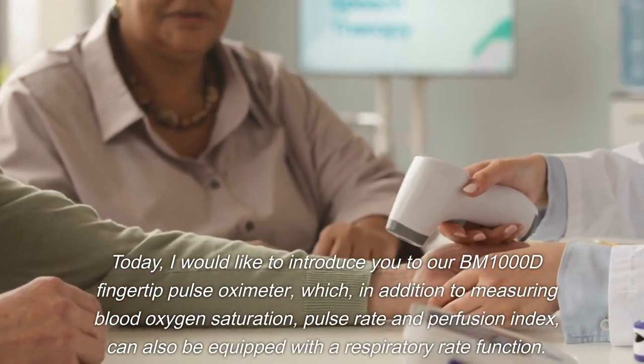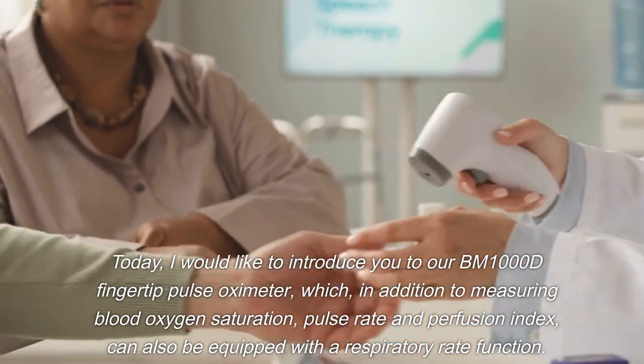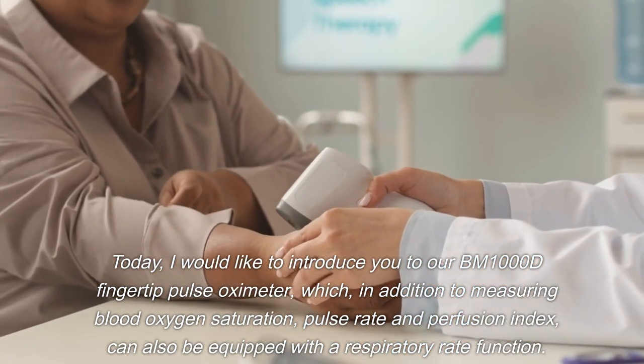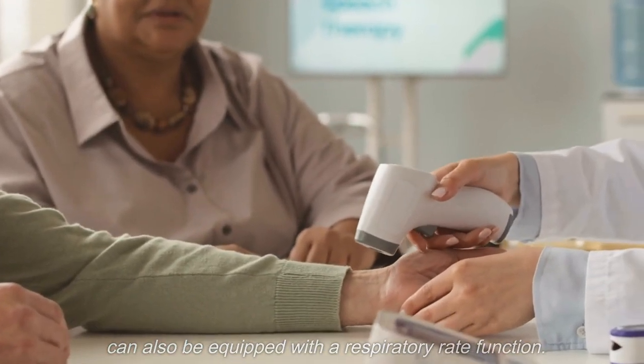Today, I would like to introduce you to our BM1000D fingertip pulse oximeter, which, in addition to measuring blood oxygen saturation, pulse rate and perfusion index, can also be equipped with a respiratory rate function.